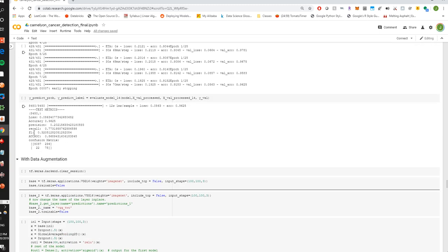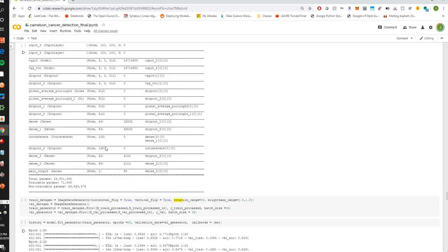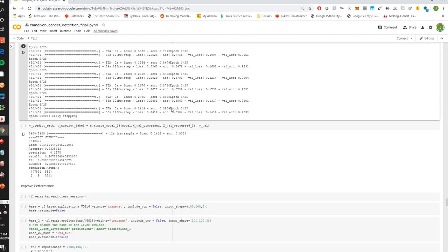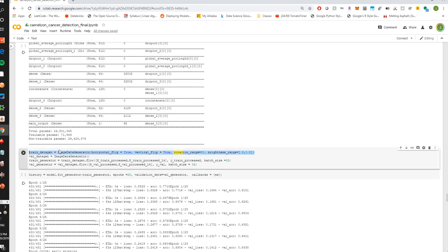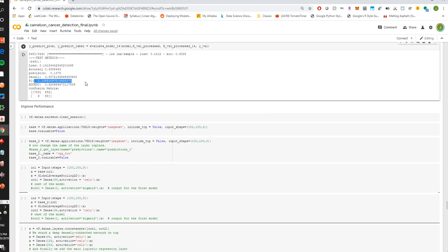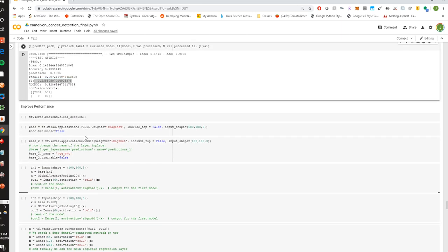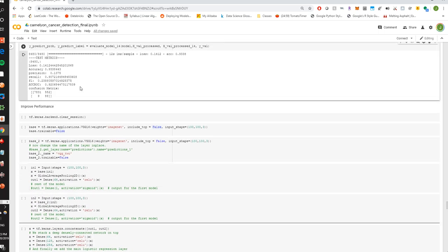These are the results. The F1 score is 32%, much lower. This is another 2 zoom level model, but with data augmentation. Here we're doing data augmentation. Oh yeah, the F1 score is a lot lower. So I take this 2 zoom level model and ask how I can make this better, because it's not doing very well. The recall is extremely high, which is good, but precision is really low.